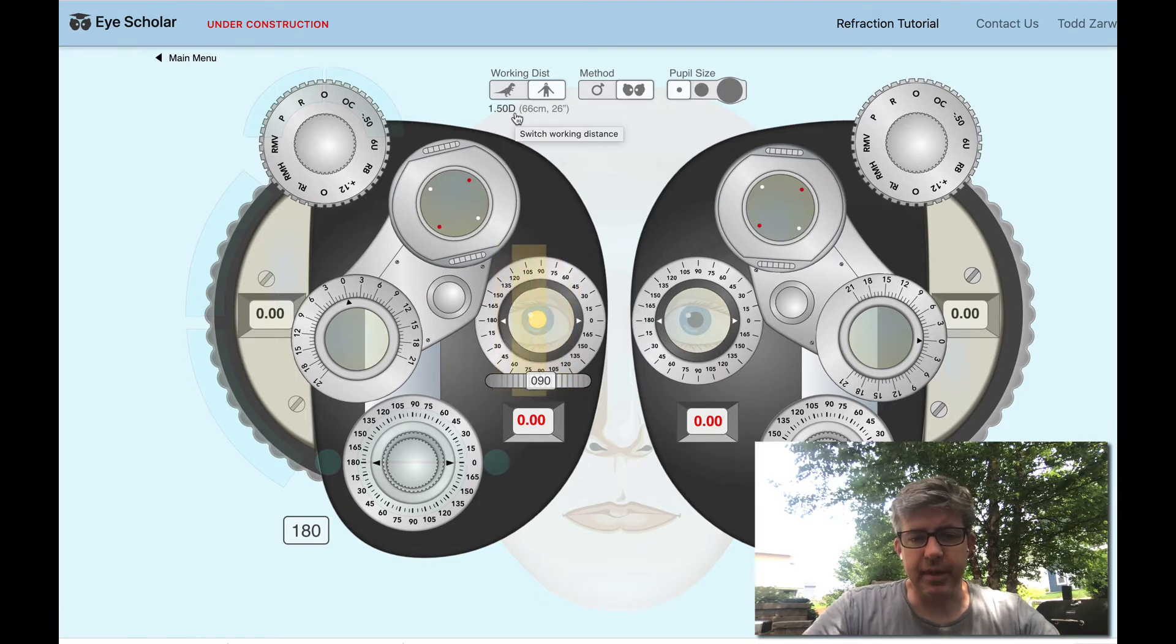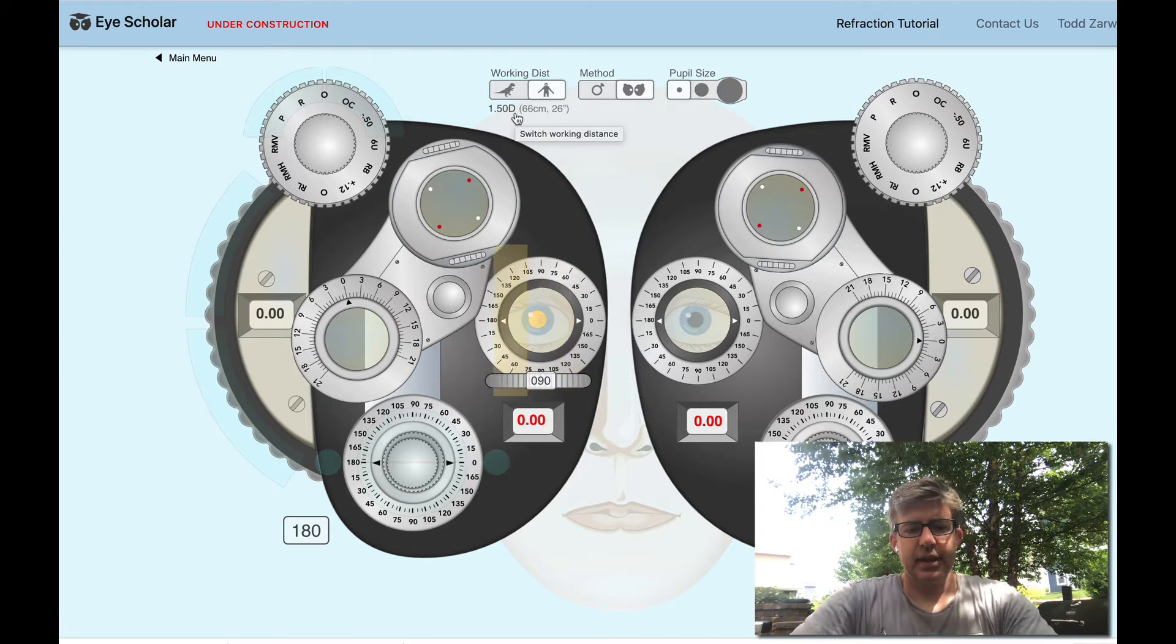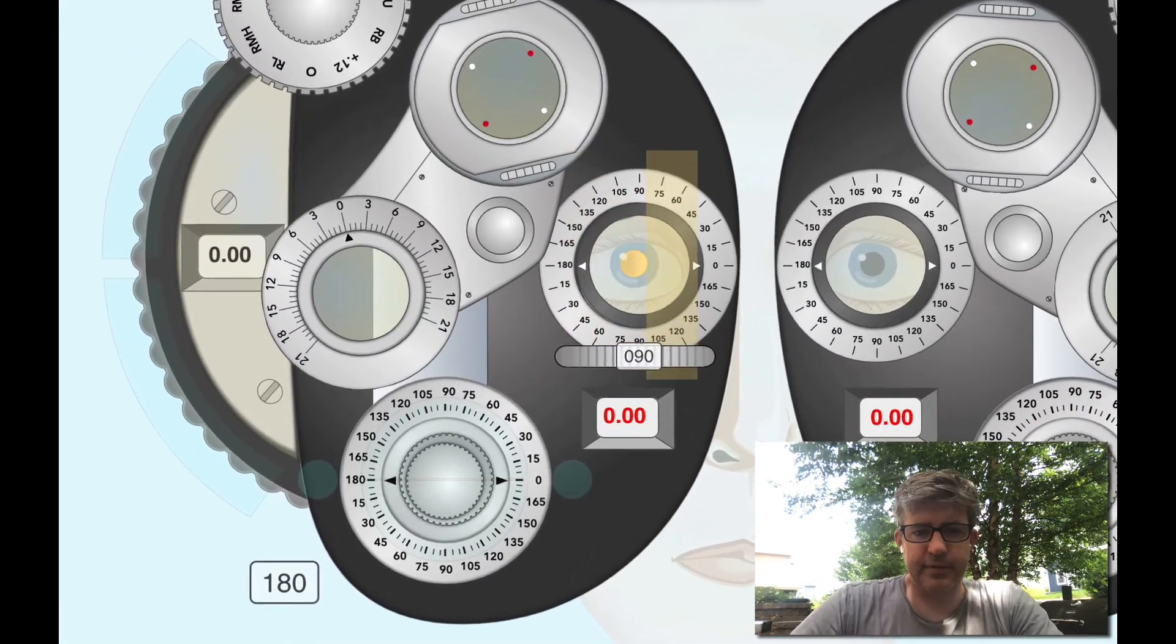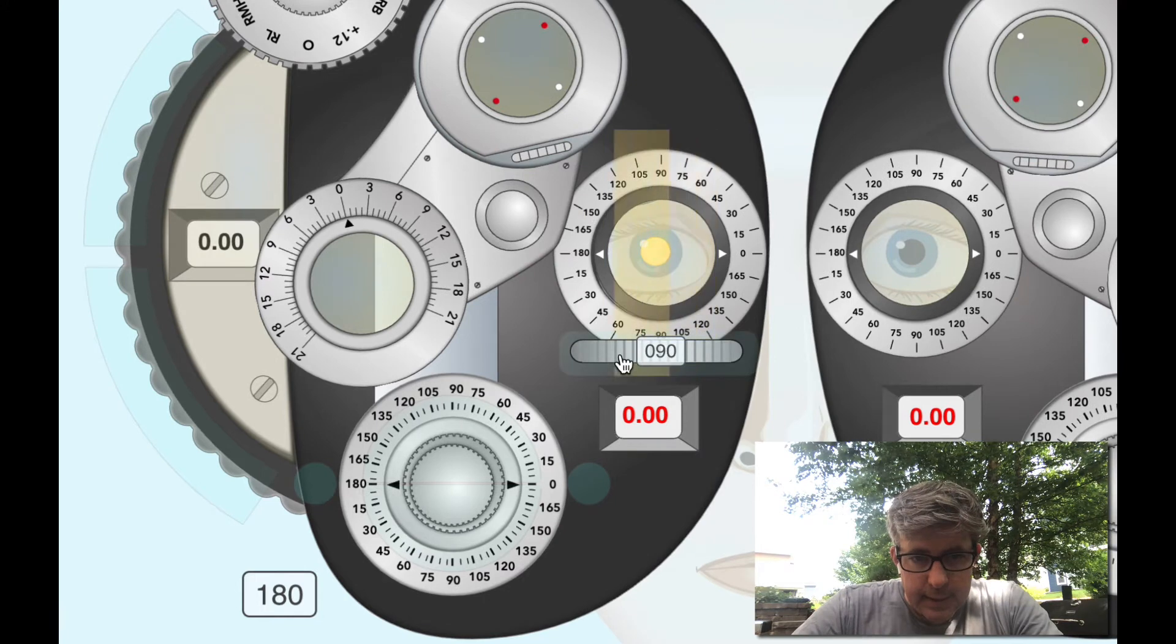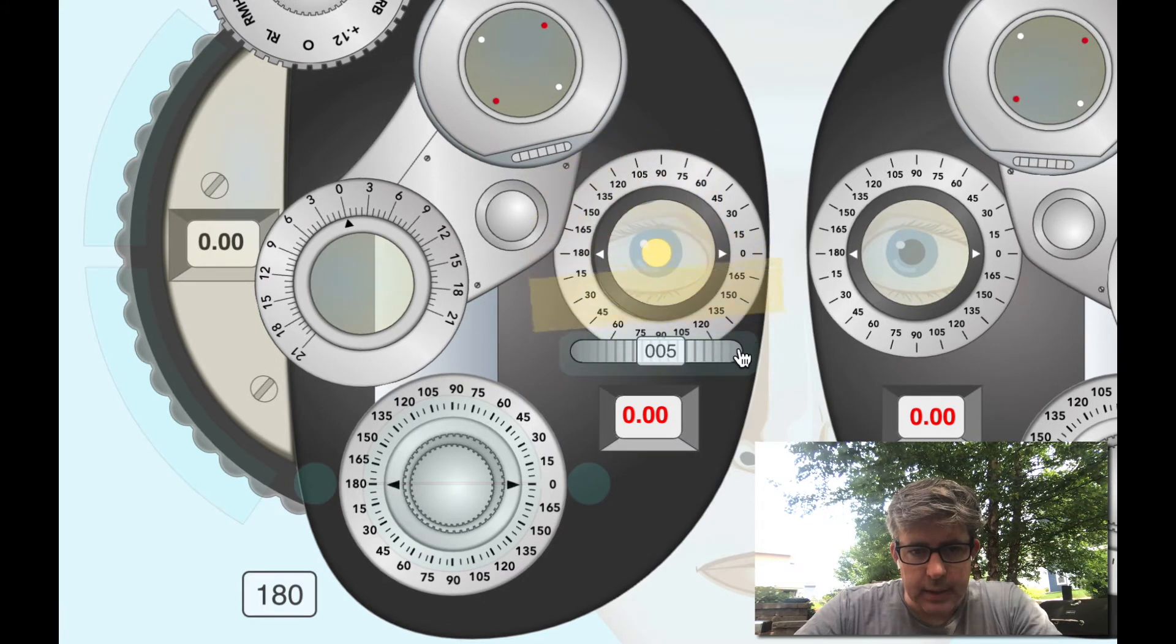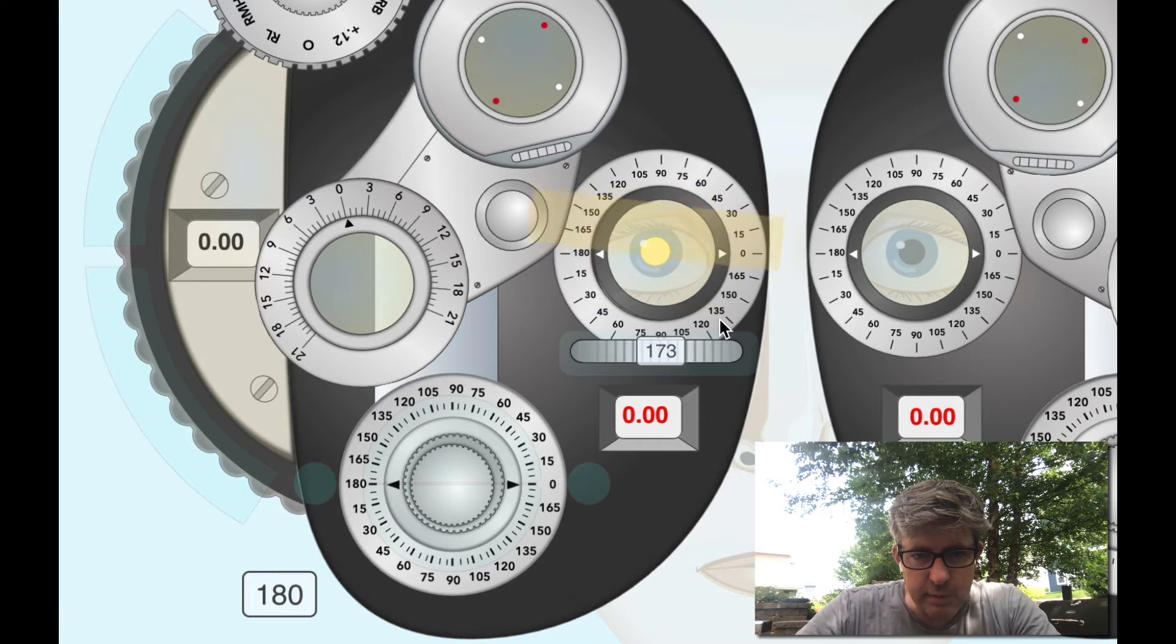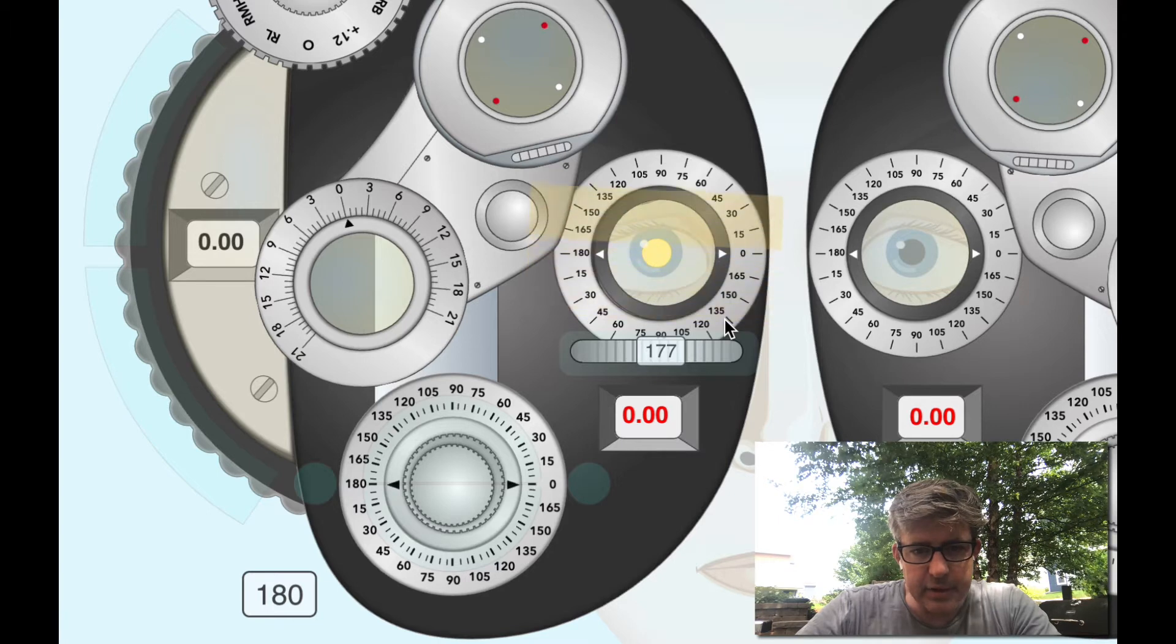Let's get started. Let's just see what we're seeing here. I'm seeing a little bit of with motion currently and it looks pretty neutral right here. This might be an easy one, so maybe I should start over. Yeah, pretty neutral there.